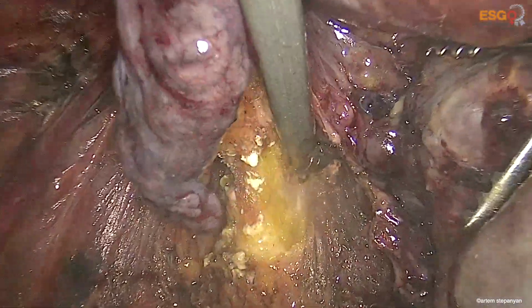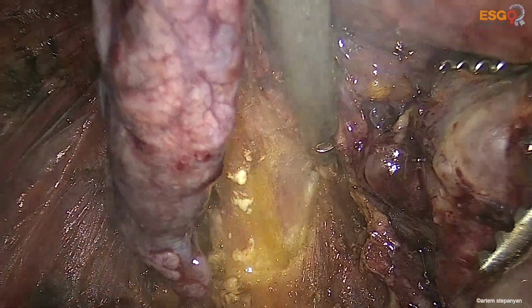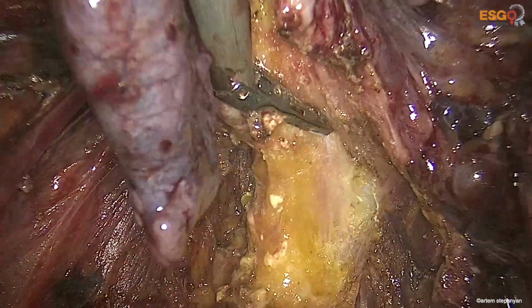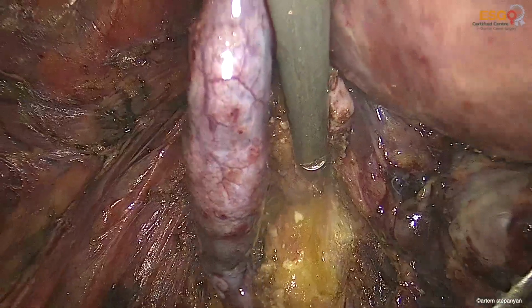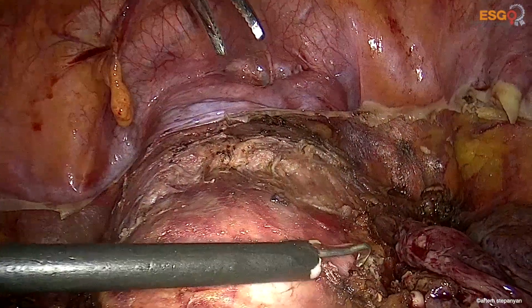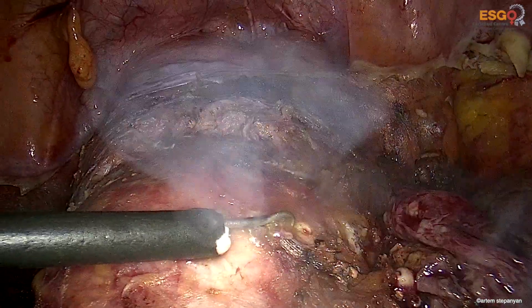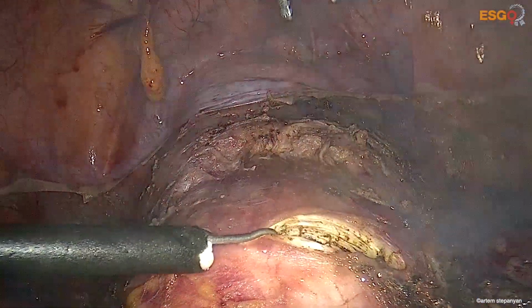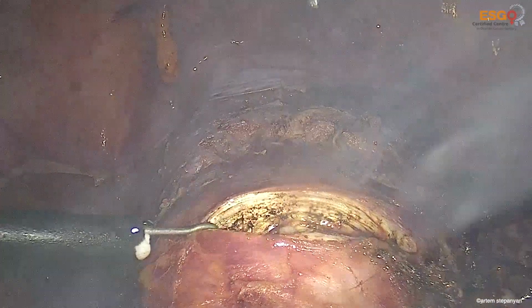We proceed our dissection between the mesorectum and the Denonvilliers' fascia, trying to achieve the posterior fornix of the vagina. Once the posterior fornix is achieved, we proceed with the colpotomy.